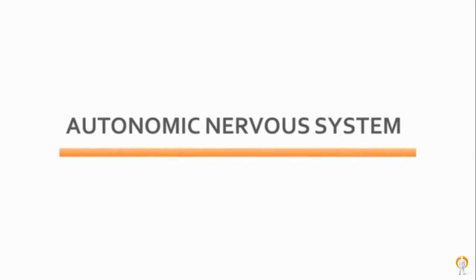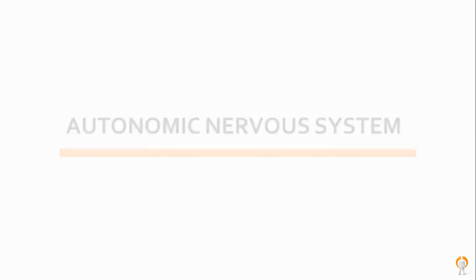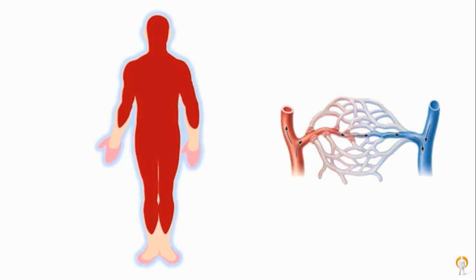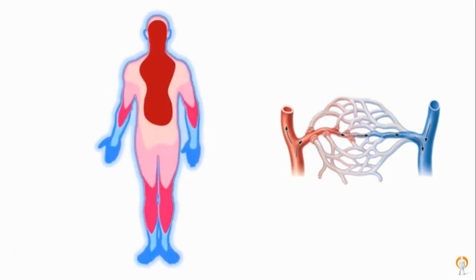The autonomic nervous system influences temperature regulation throughout the body, and in response to both internal and external stress factors, it manipulates capillary blood flow to and from the skin, which results in heat emission or withdrawal from the skin's surface. For instance, in our test, we expose the whole body to cool, room temperature air. The autonomic response then causes the capillary beds to shunt blood away from the skin to the head and body core, thereby maintaining essential organ temperature and oxygenation at the expense of skin temperature.